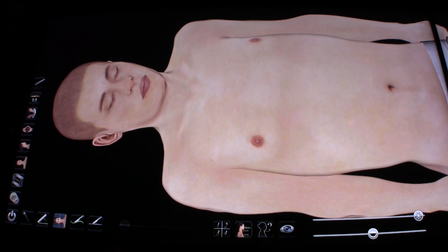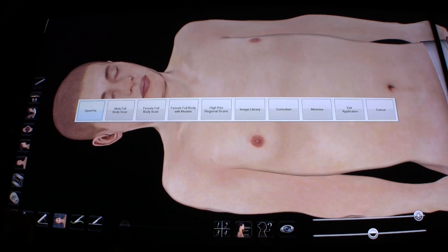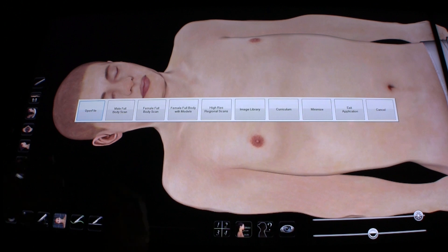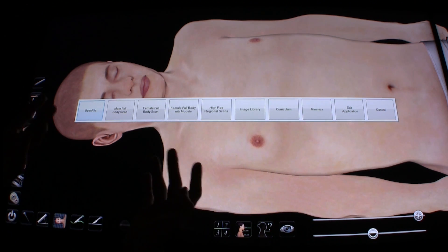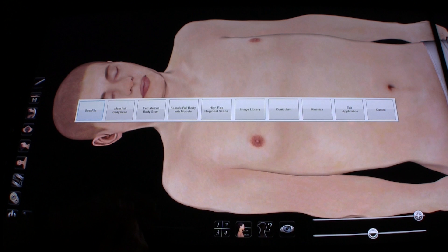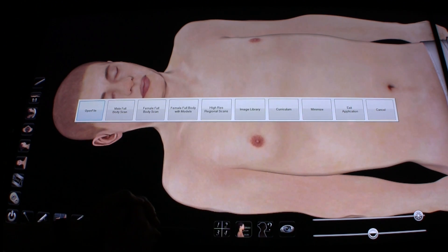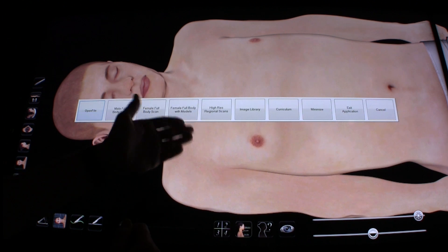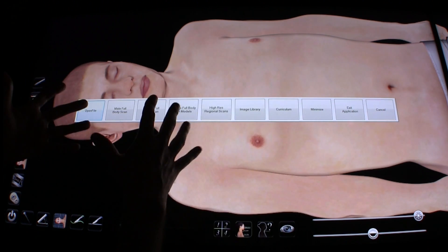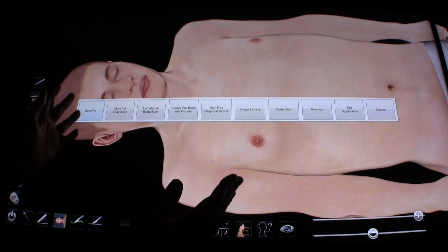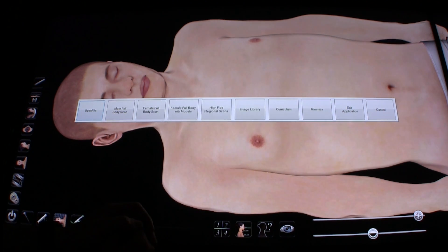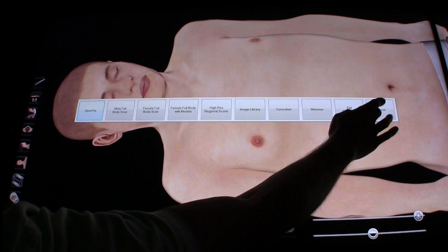Last but not least, I'll show you the file menu. It's in the bottom left-hand corner and looks like a power button. This allows you to load various other models. The open file button allows you to open your own images or scans from a flash drive, such as in DICOM file format. You've got the male full body scan which we have loaded, and there's a female version available as well, including a more computer-generated model. There are also higher resolution regional scans — for example, if you're only interested in the head and neck, you can load just that at higher quality. There's an image library with hundreds of cases available, from diseases to surgeries to animals. There are also some curriculum examples available, and you can minimize or exit the application or click cancel to go back.